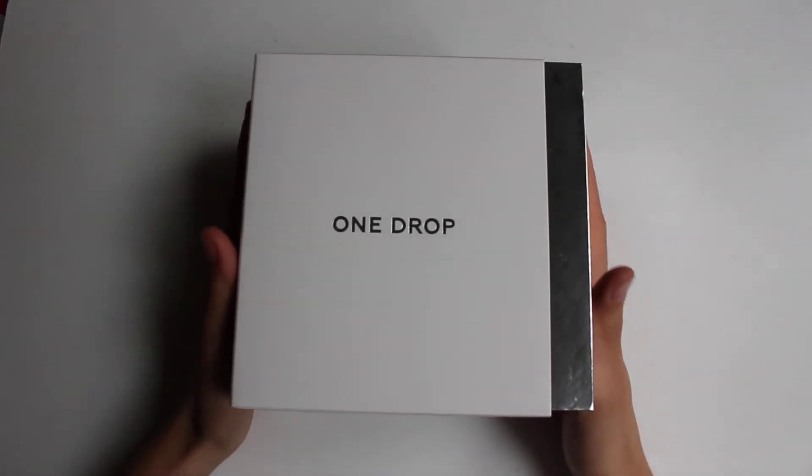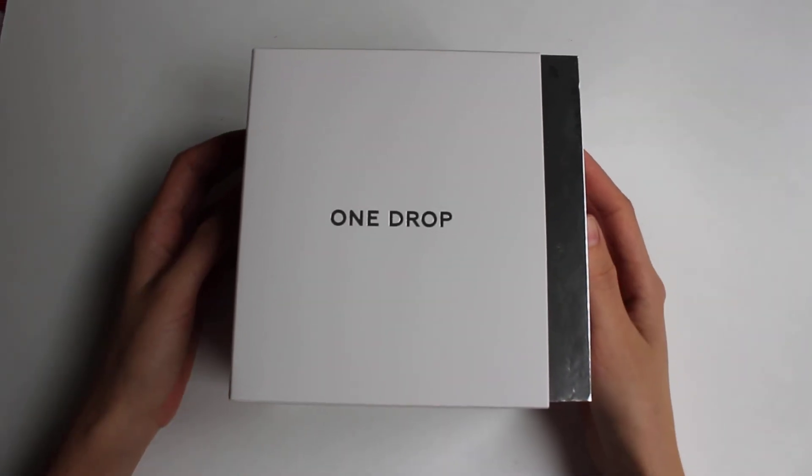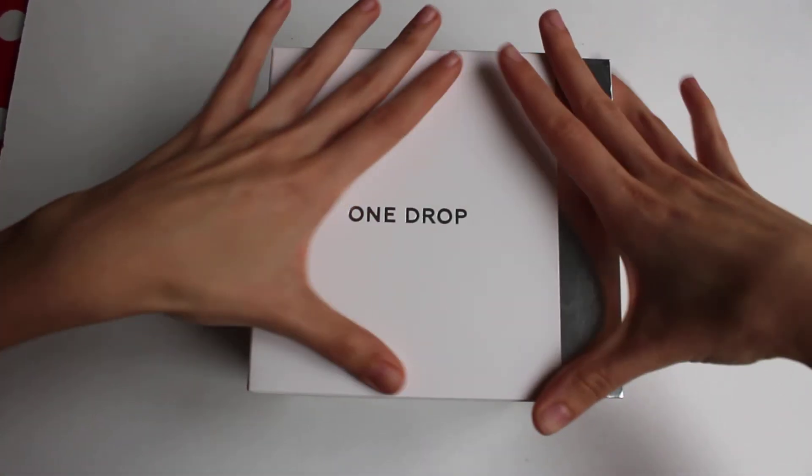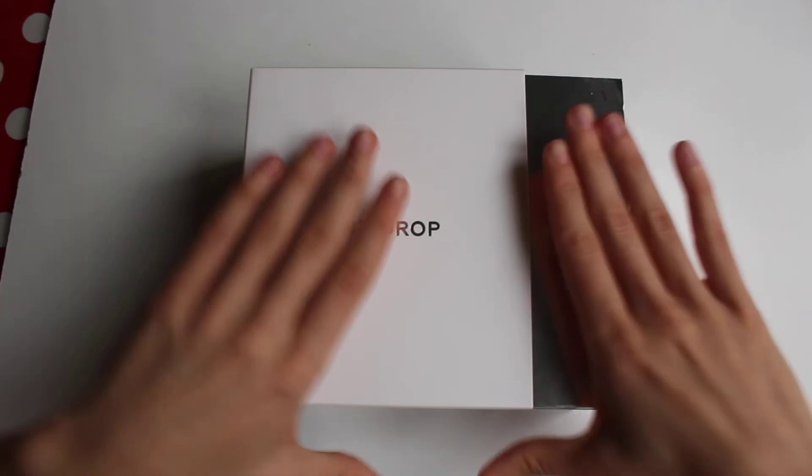Hi guys, I've just received this package from OneDrop. It's a new glucometer and I'm going to do a quick unboxing to see what is inside.